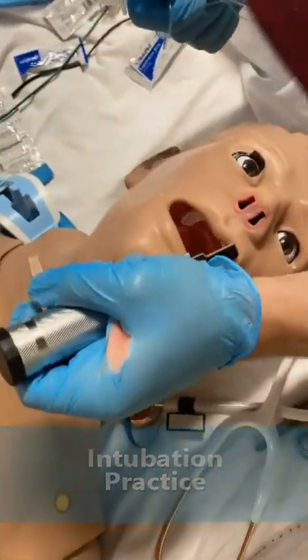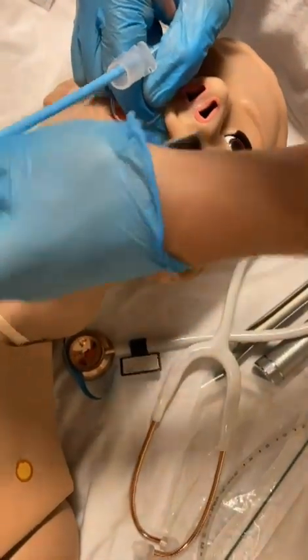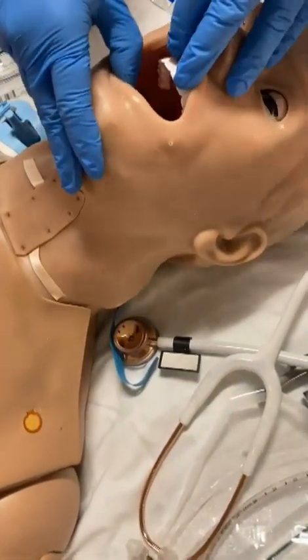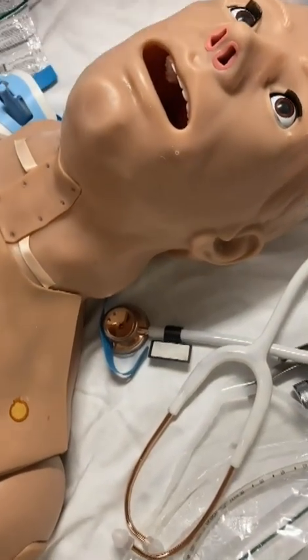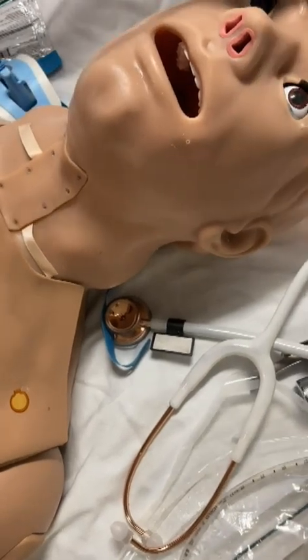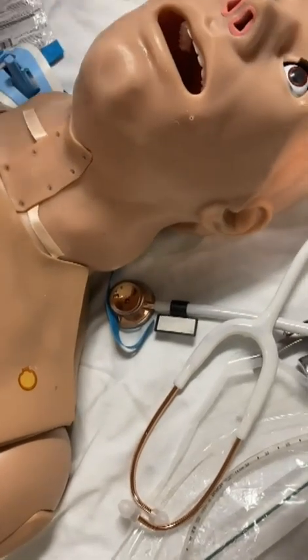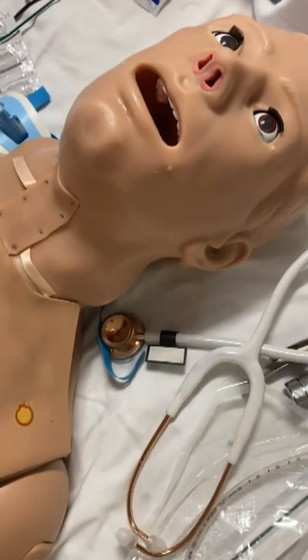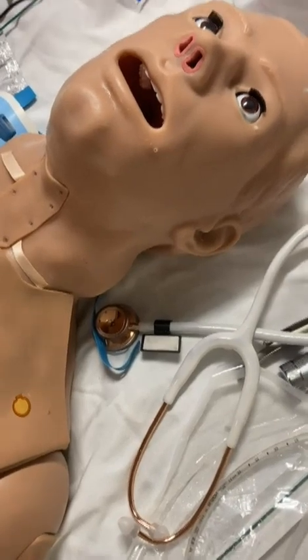I still don't know what I'm looking at. I don't want to pull myself too deep — you just busted his teeth out again. We're going to pull it out — this is part of the process, on purpose, just to get a feel for it first. I'm going to go in and sweep that tongue — not burying it, just doing a sweep. You own this airway. What would be the best positioning for this patient?